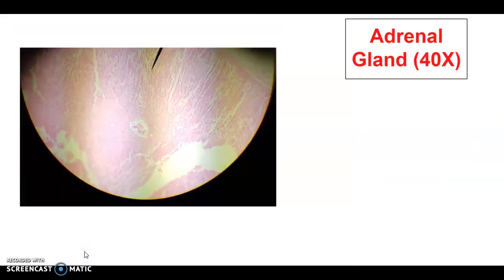Okay. Let's look at the next gland, the adrenal gland. And what are we looking at? This layer. So how do I recognize the adrenal? Because you're seeing cord-like structures. Do you see this string of cells? These cord-like structures, it is an adrenal gland. Now, how do I know which layer of the adrenal gland? Of course, we're looking at the cortex. So remember, the cortex is the outside, the medulla is the inside, right? So here the outermost layer is what? Glomerulosa. Then is what? Fasciculata. Then is what? Reticularis. So this layer is the second layer of the cortex, which is the zona fasciculata.